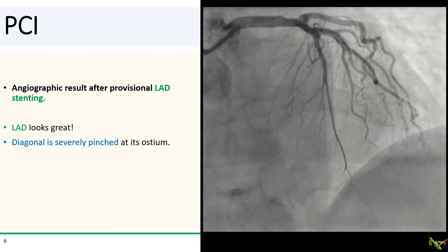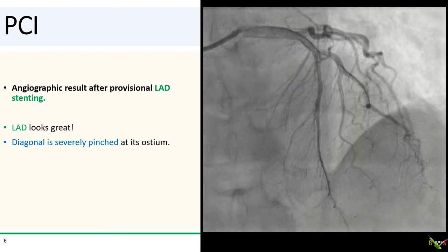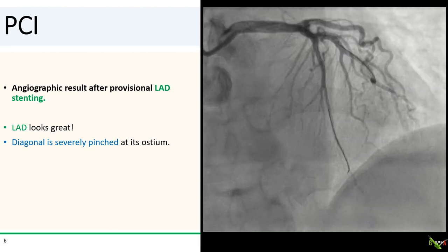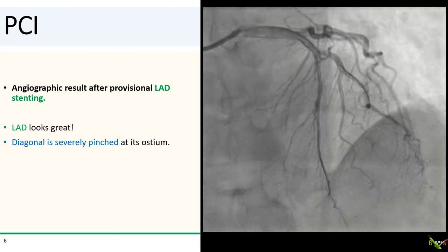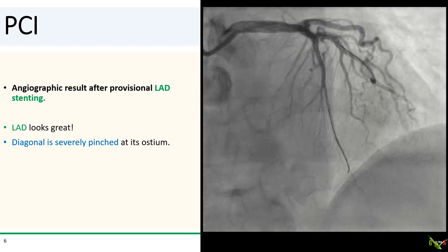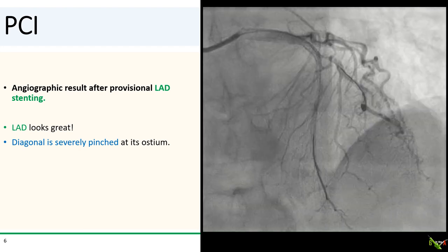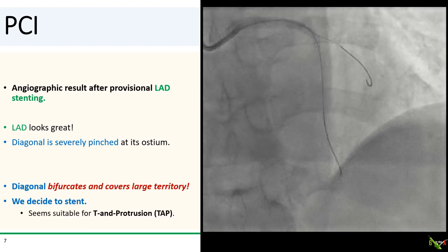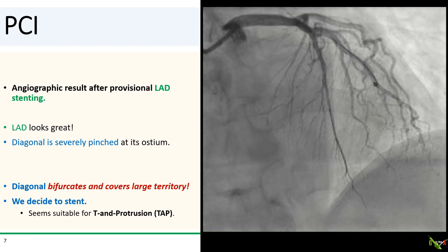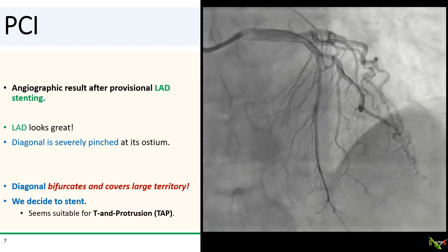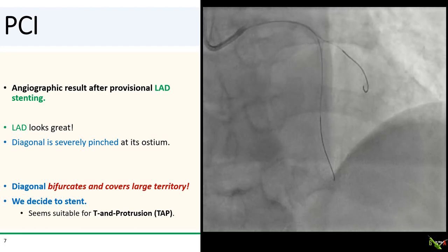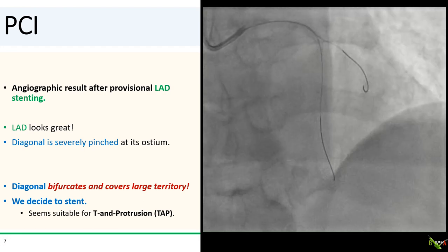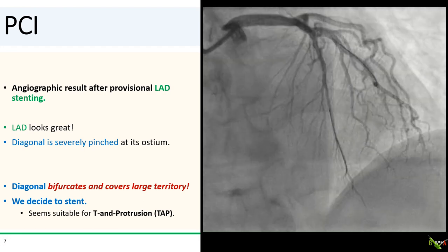Looking at it from a different angulation, it's clear that the diagonal became severely pinched at its ostium. Unfortunately, that diagonal branch does bifurcate and covers quite a bit of myocardium, so we felt that we had to go ahead and stent it.